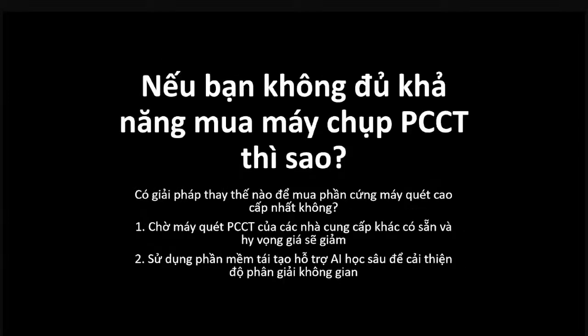Now, what if you cannot afford to buy a PCCT scanner, because these are 3 times the cost of a Aquilion Prism? Are there any alternative solutions to buying this? Well, first you can wait for the other vendors' PCCT scanners to be available and hope the price comes down, which I actually think is unlikely because of the high cost of development. You can use the other alternative, which is deep learning AI assisted reconstruction software to improve spatial resolution.